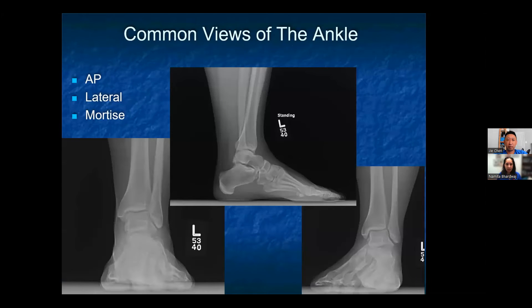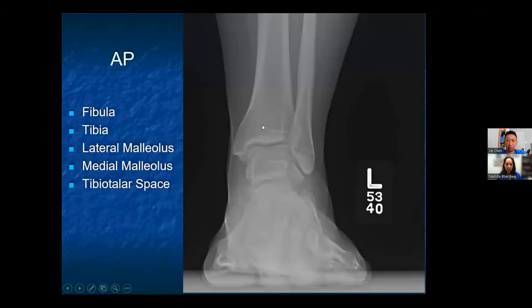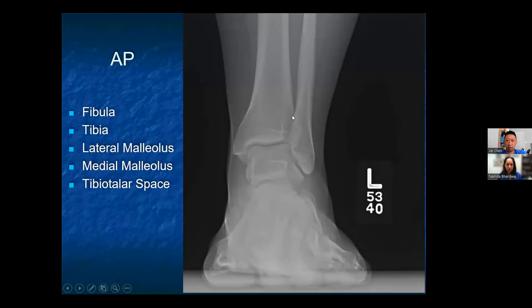When we look at the ankle, there are three common views that you're going to do: the AP, the lateral, and the mortise view. The ankle consists of three bones — the tibia, the fibula, and the talus — and it consists of two joints: the ankle joint, which is where the tibia, fibula, and talus meet, and the syndesmosis, where the tibia and fibula meet.